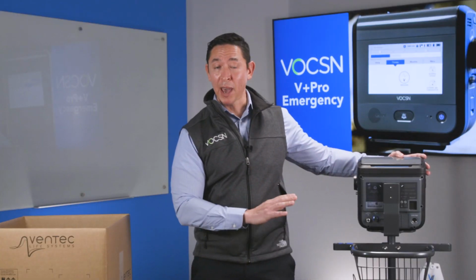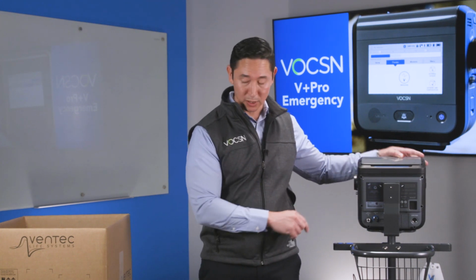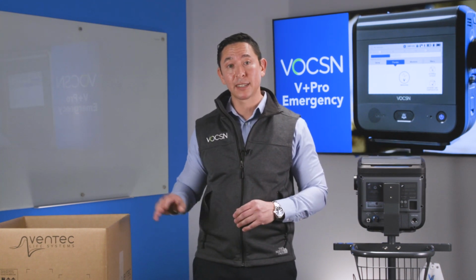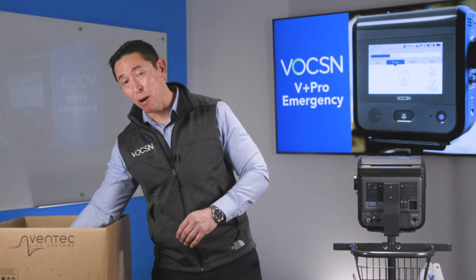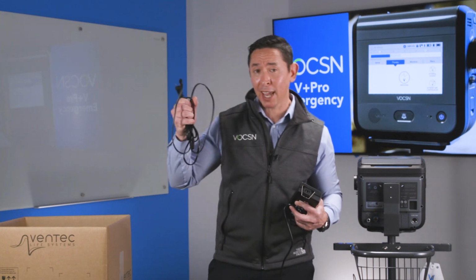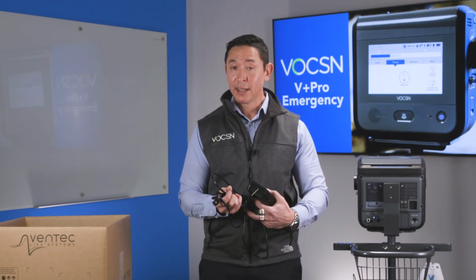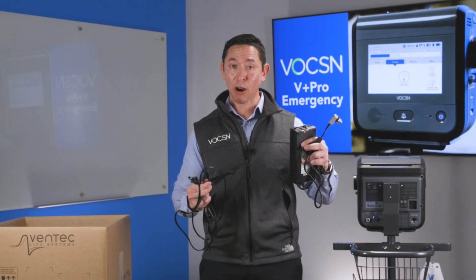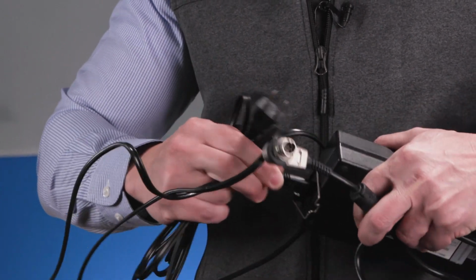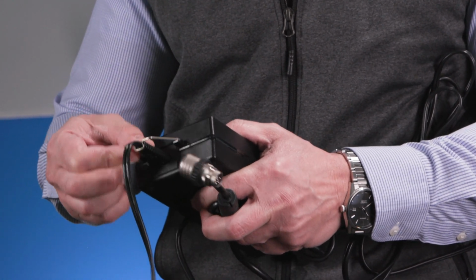So I'm going to start at the back of the device so I can show you how to plug it into power as well as connect to oxygen sources. The next thing I'm going to grab out of the box is my power source. The power source is going to come with two pieces. I have the cabling right here, and then I have the power brick that's going to connect to the back of the device. The cabling is going to connect to the power brick just like this. And then you'll actually have a retention clip that locks it into place.